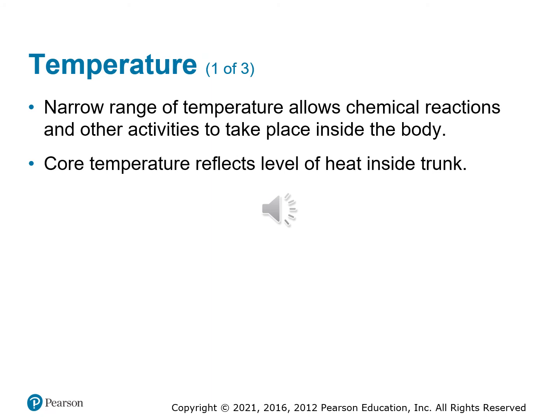Okay, on to temperature. And as you know, with COVID these days, temperature's kind of become an important assessment tool because it does tell you what's going on inside the body. And we know with COVID that low-grade fever and even a high temp is pretty common. So it's a good tool if they're having flu-like symptoms. Measure that. It may indicate a little bit more as far as that range goes.